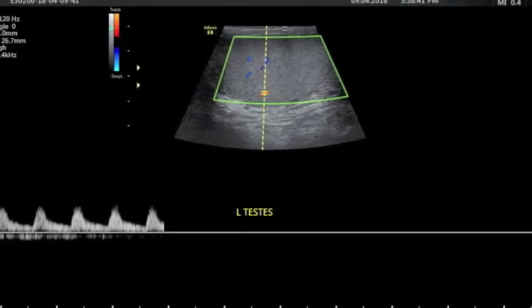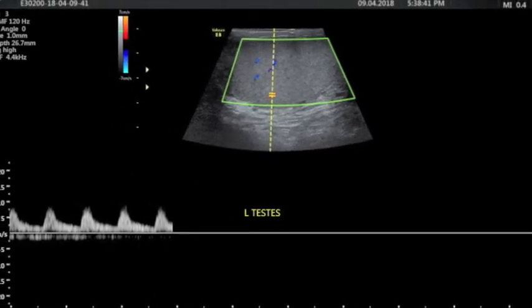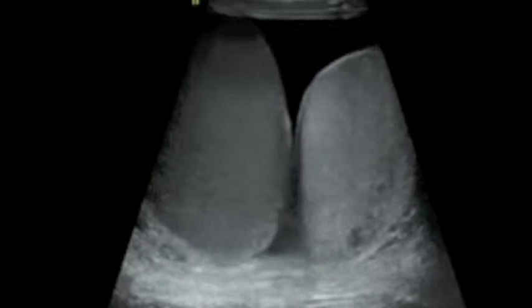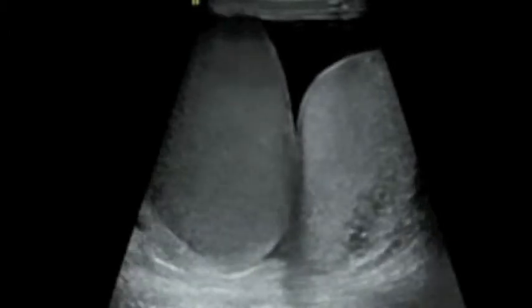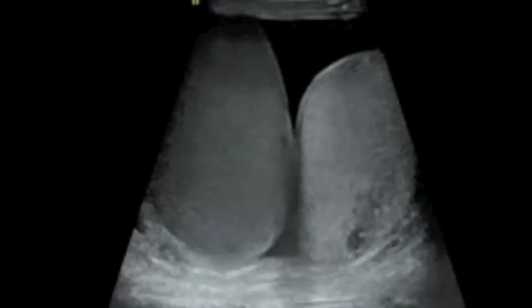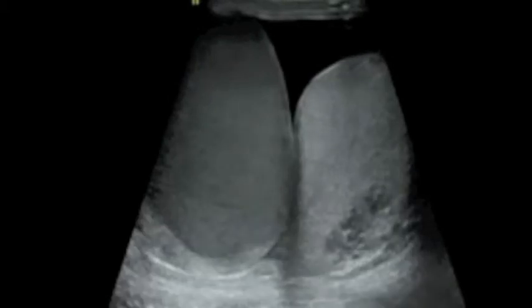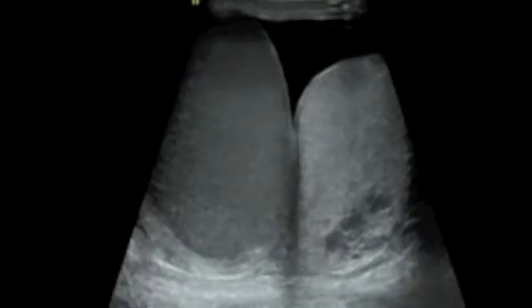We then turn our attention to the affected side. It's not a bad idea to take a transverse section across both testes at one time so you can actually compare the echo texture. As you can see on the screen, the testes on the left side is nice, bright, and smooth as it should be.